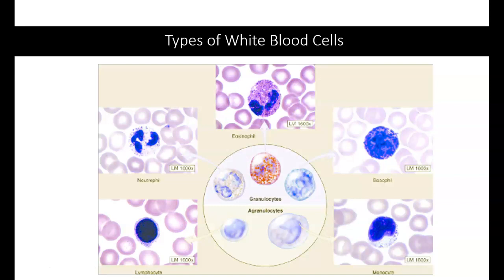Basophils are really small cells, and basically their job is to sound an alarm when an infectious agent invades the blood. So they're kind of like a tornado siren, sort of. They secrete chemicals like histamines as markers of allergic diseases, and that helps control the body's immune response. So they're going to be, like I said, the siren or the all call: hey, there's something in here that's foreign that we need to set into motion our immune response to defeat it.